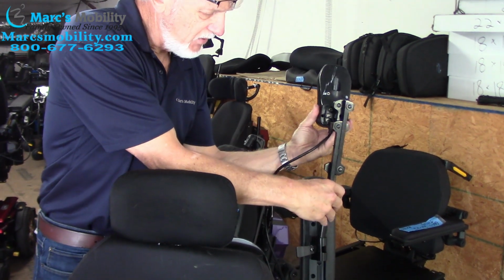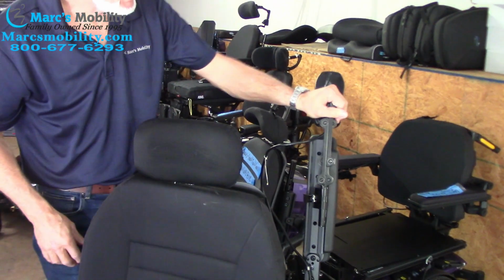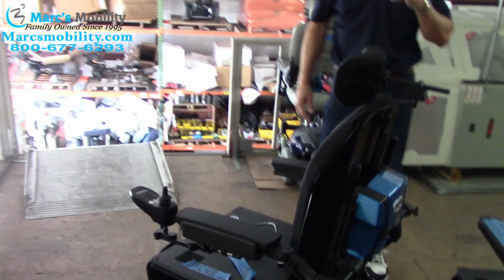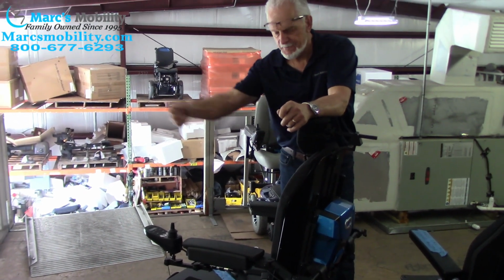Okay, so you just slide it back on here all the way to the end, wherever you want it, and push this down so there's no play, and you're ready to go. Everything will be on the left side. All right. So the first thing you'll do, as I said earlier, is disconnect the cable from the back of the chair, pull it through that hole right there.